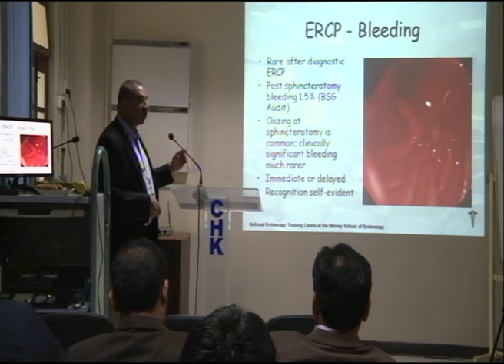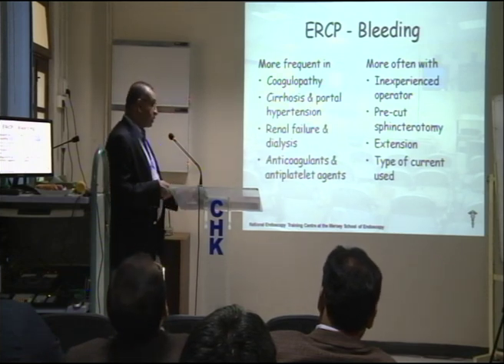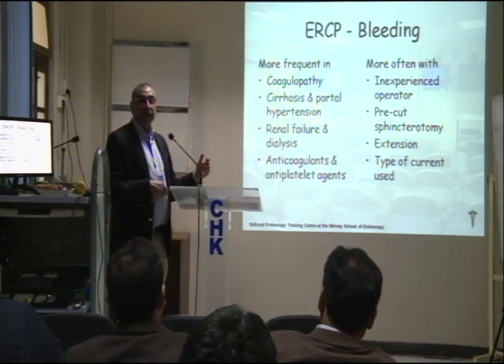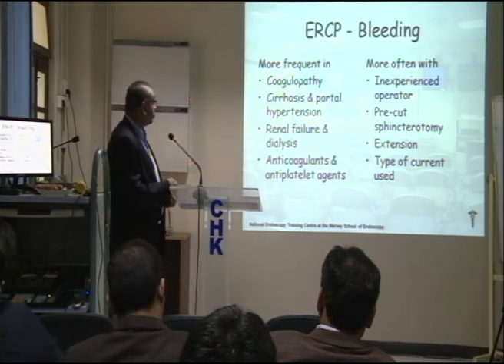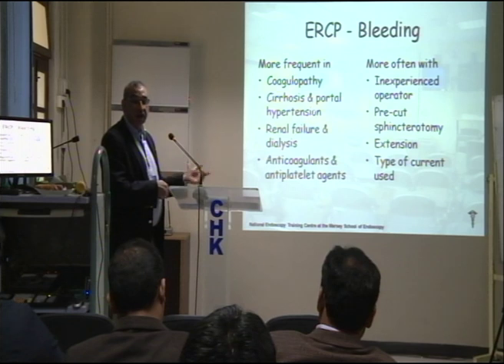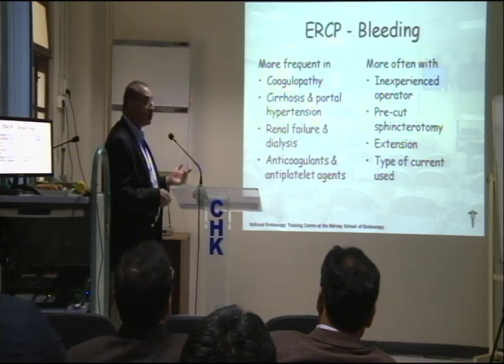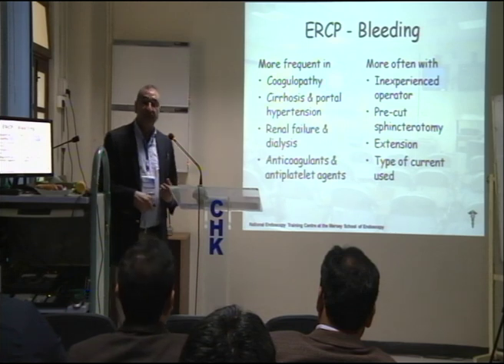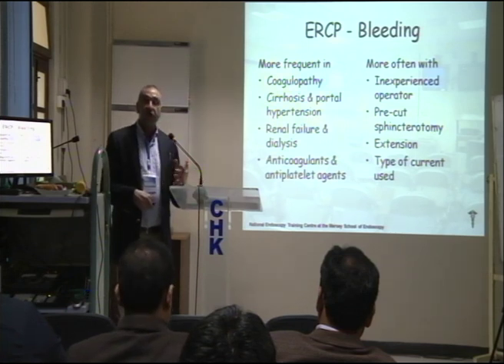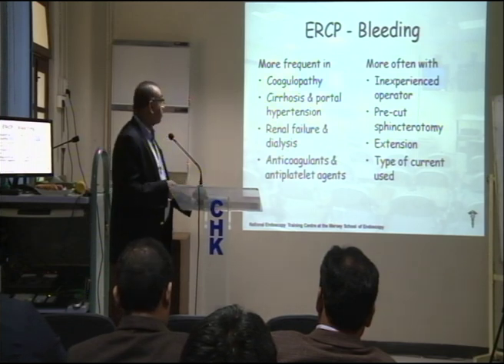have stopped. If it has not, then you can carry out treatment, and that would include either further coagulation with the sphincterotome, or injection of adrenaline, the first thing that we do, or you can use a hemoclip, or you can use hemospray, anything that would stop it. If it is massive bleeding, we tend to use fully covered metal biliary stents. It causes tamponade and stops the bleeding.